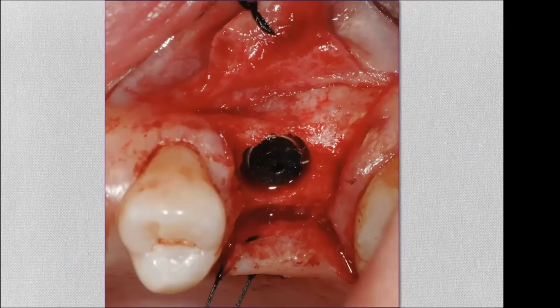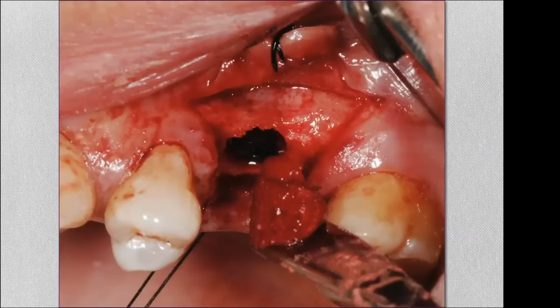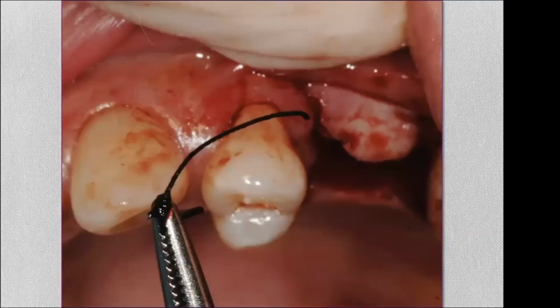Place it, okay? Then we take the autogenous bone, which I set aside. More often than not, I will leave it if I'm doing a 2-stage implant and just place this right near the incision. A, it heals more quickly. B, if some particles of it are out. So I noticed, by the way, I cleaned all of these little loose particles, the stray particles of the SynthoGraft are gone. And when we put autogenous bone in there, if a little bit of it comes into the incision or into the soft tissues, it is not a problem. It doesn't cause this irritation to the patient that can be inflamed and tender and so on. Okay, so it heals better, it looks better, it feels better, and it heals more quickly.